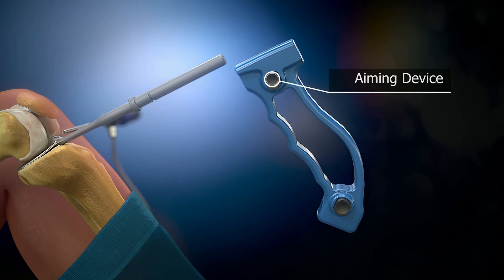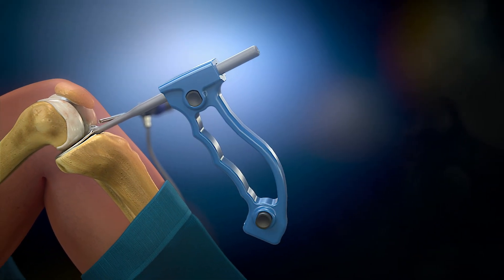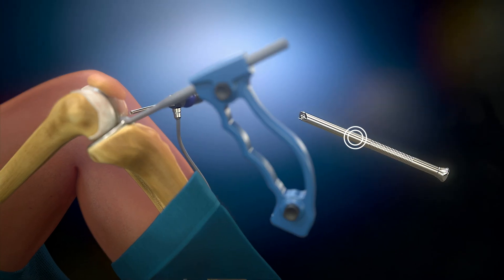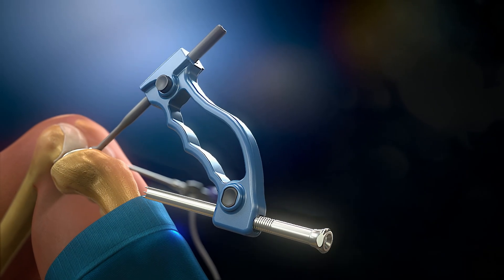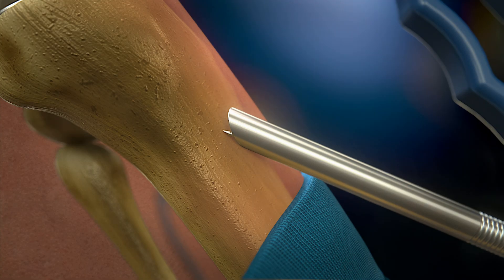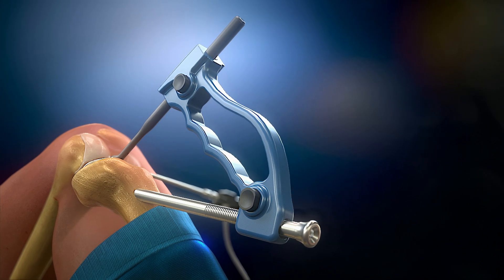Then the aiming device is connected to the trial sizer and the trophine is inserted into the aiming device. A small incision in the skin is made at the location of the trophine on the front of the tibia. The trophine makes contact with the patient's tibia and the sharp points are fixed in the bone of the tibia.